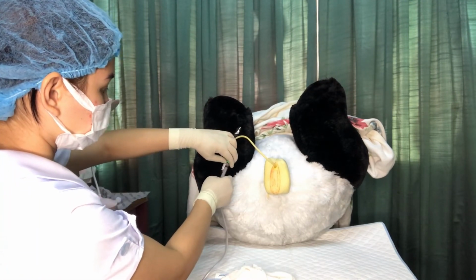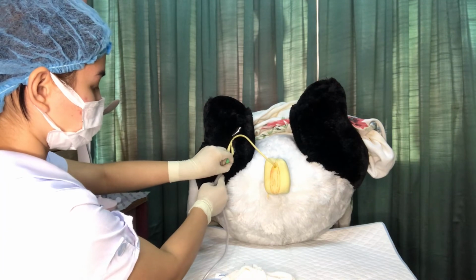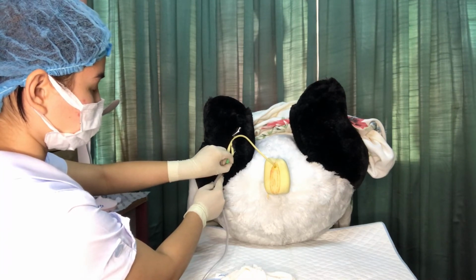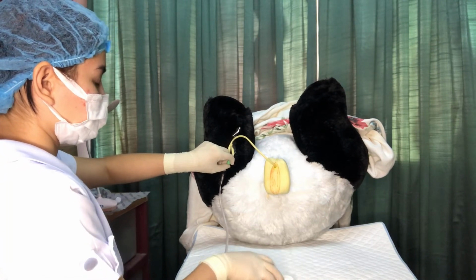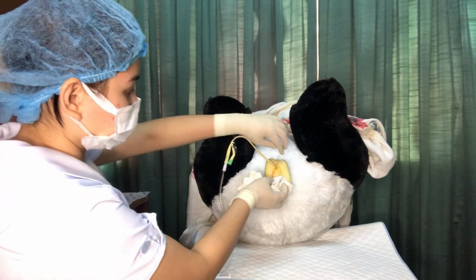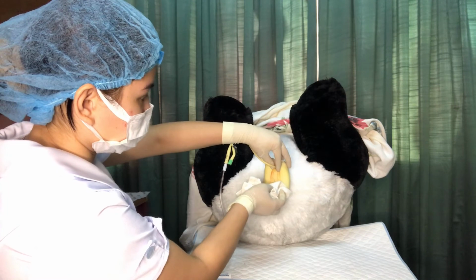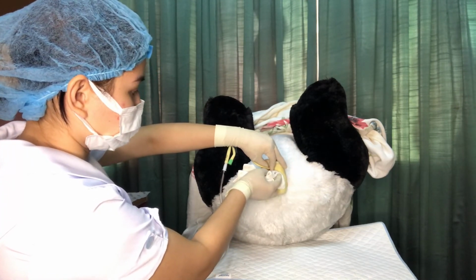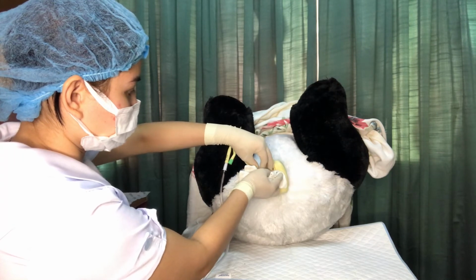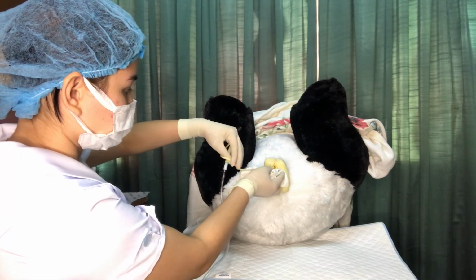If you're going to collect some specimen, you may do so. And for this one, we're going to remove the Foley catheter. We have here a towel and a syringe. So I deflated the balloon, wiped the genital area, and then warned the patient that you're going to pull the catheter. Then we're going to pull it slowly.